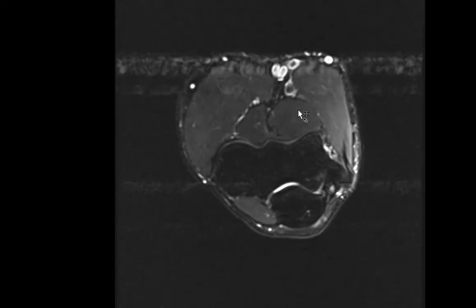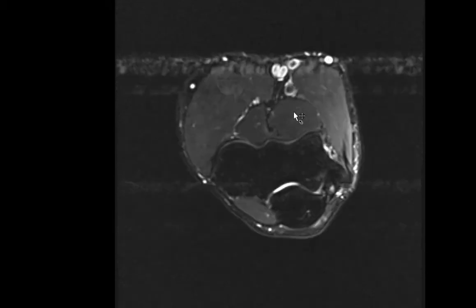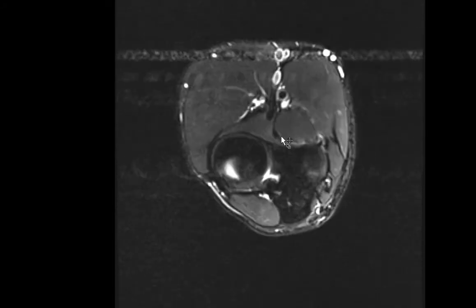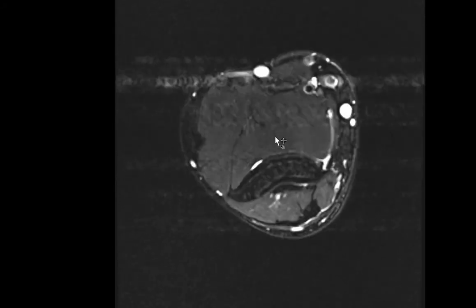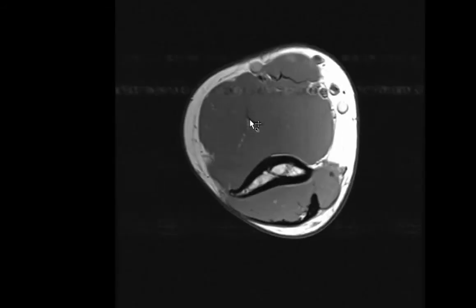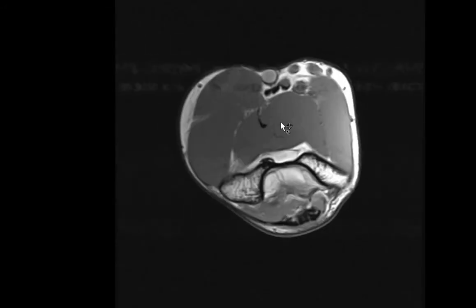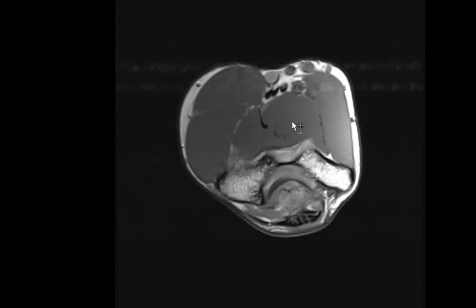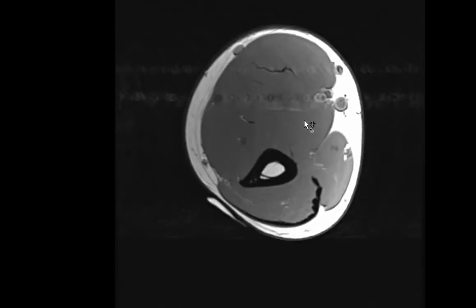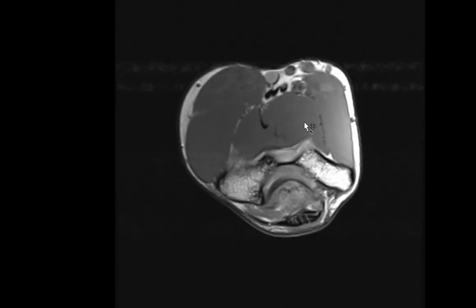I also want to assess the muscles — brachioradialis, brachialis, pronator teres, supinator, the extensor and flexor compartments — making sure there's no T2 hyperintense signal suggesting intramuscular edema from a contusion or muscular strain, which I don't see here. On the T1 weighted images I confirm normal muscular bulk with no T1 hyperintense signal suggesting atrophy. Vascular flow voids are maintained as well. That's my evaluation for an MRI examination of the elbow. I hope that has helped you, and thank you so much for your attention.